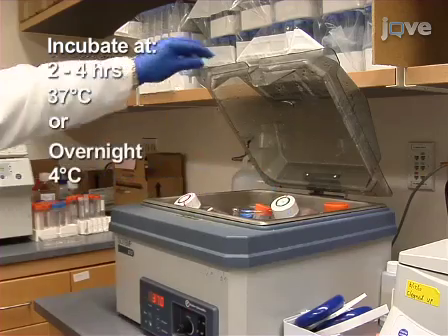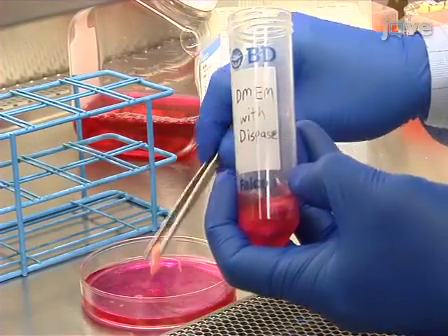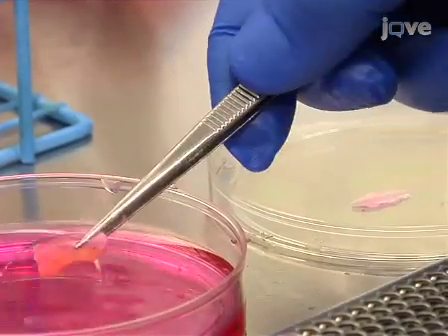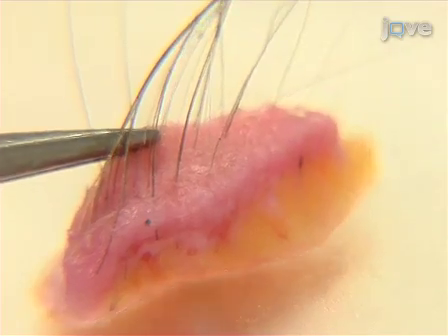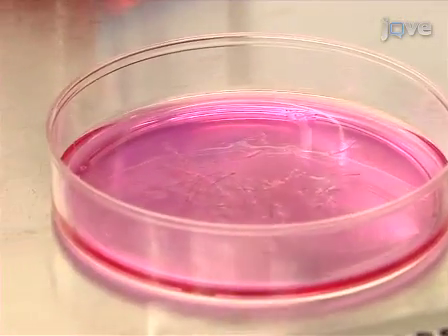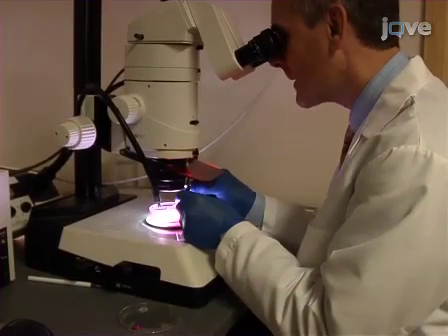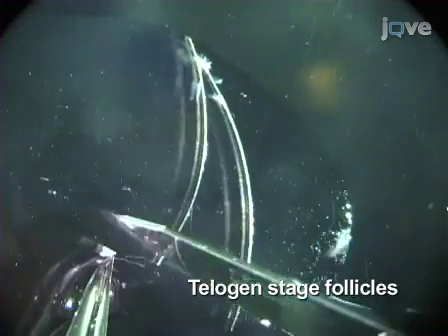Incubate the sample for 2 to 4 hours at 37 degrees Celsius. After the incubation, rinse skin with fresh DMEM containing 10% FBS and place in a sterile petri dish. Collect the follicles by gently pulling each hair firmly and smoothly from the base with forceps. Place isolated hair follicles in fresh media.